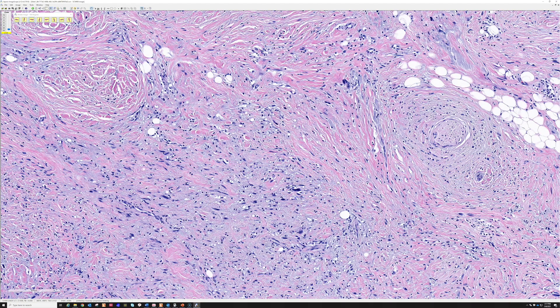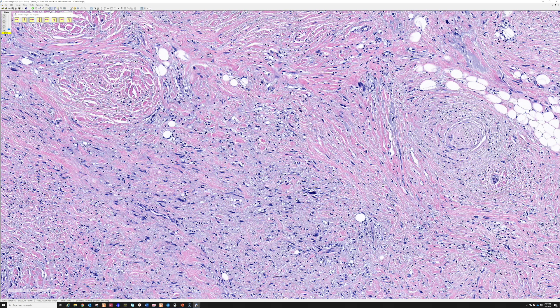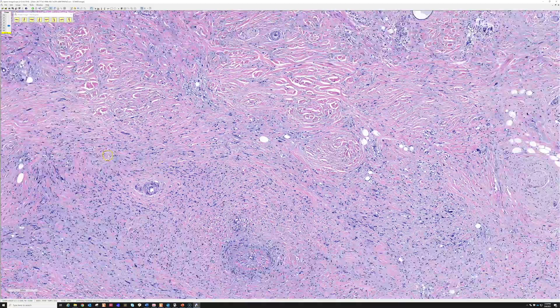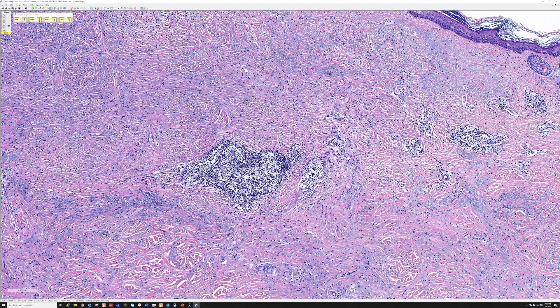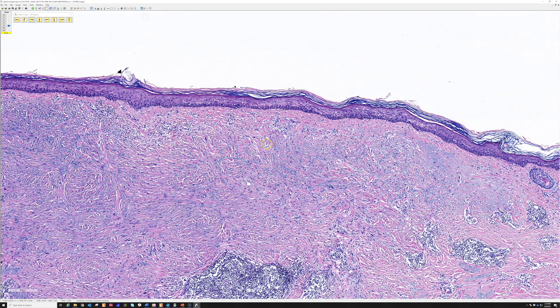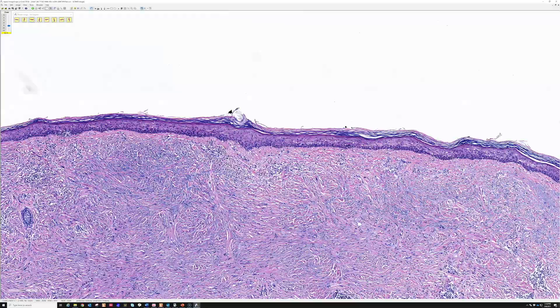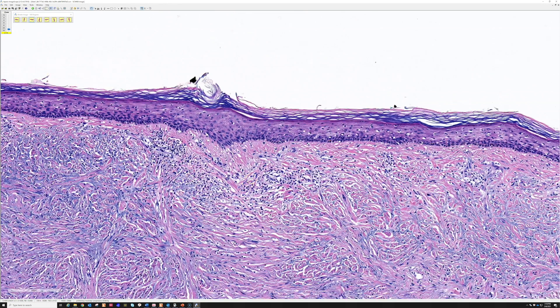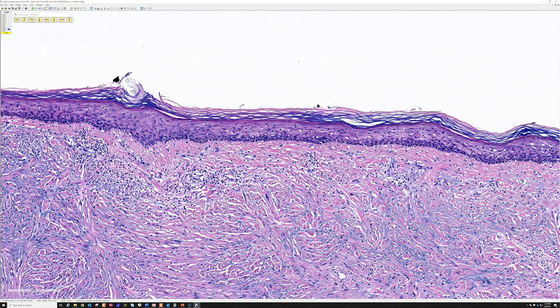Desmoplastic melanomas are very scary because they don't look at all like conventional melanoma when purely desmoplastic. They can look like scar tissue or even a neural lesion like a neurofibroma. The clues are scattered pleomorphism and lymphocyte aggregates, present in the majority of cases - though on a small shave biopsy you may not see them. You should always look for a melanoma in situ component over top, but that's only present in about half of cases, so its absence should not detract from the diagnosis.